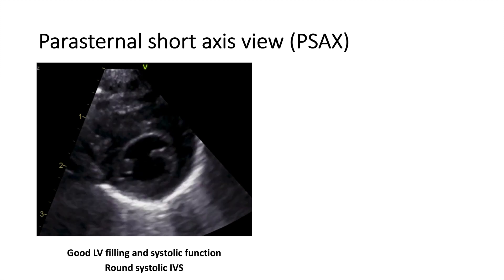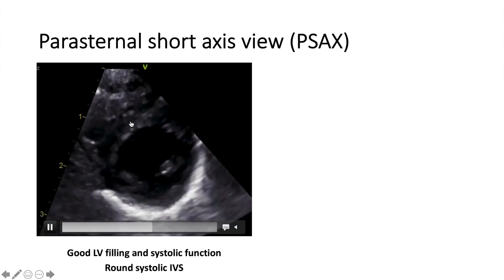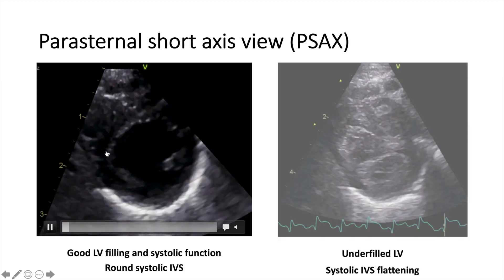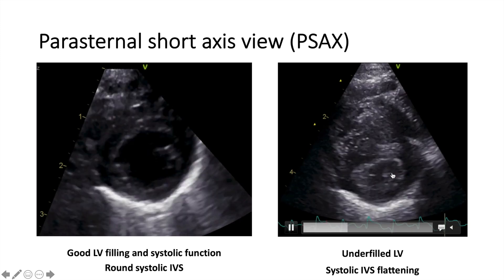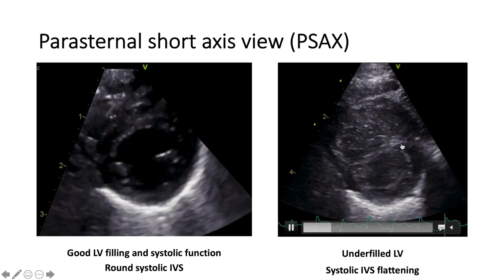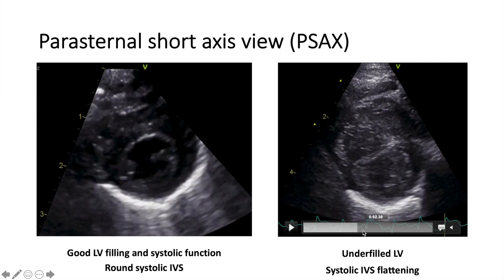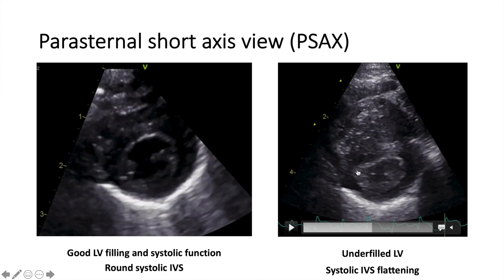We look at filling and contractility the same way as in the long axis and apical views. This short axis view represents good LV filling and systolic function — the interventricular septum is round throughout the cardiac cycle, during both systole and diastole. As opposed to this example, where the LV looks underfilled, the RV appears enlarged and dilated, and the septum is flattening during systole. This is consistent with pulmonary hypertension.